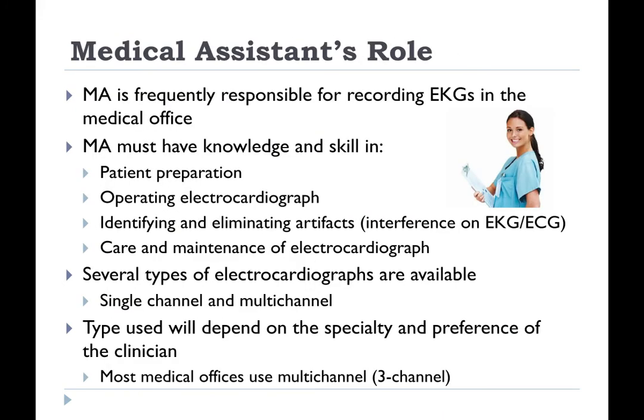What is the medical assistant's role? The MA is frequently responsible for recording EKGs in the medical office. So the MA must have knowledge and skill in patient preparation, operating the electrocardiograph, identifying and eliminating artifacts, which is interference on the EKG, and the care and maintenance of the electrocardiograph.